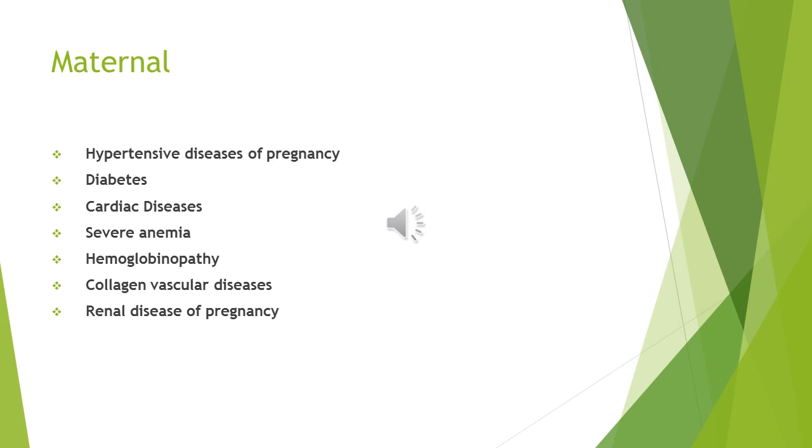In general, CTG is initiated due to any condition which can affect the blood supply going to the baby and in turn can affect the fetal well-being during labor. This can be either because of maternal side or fetal side or iatrogenic.